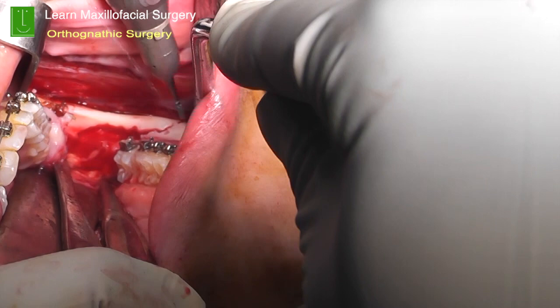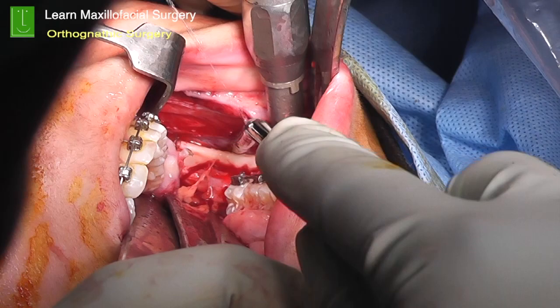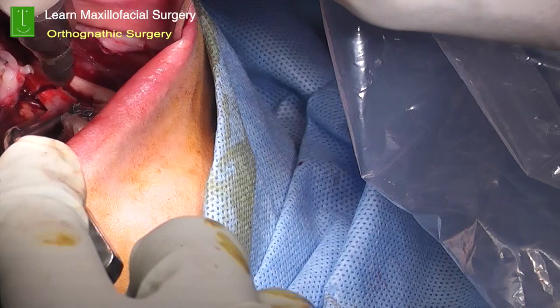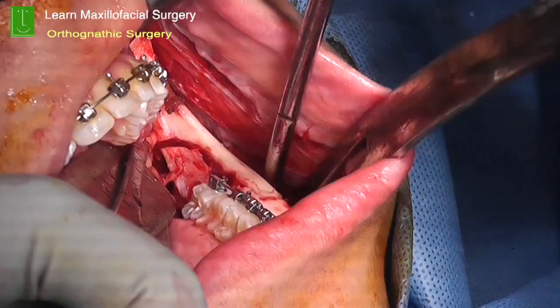Using a straight fissure burr, starting from the lower border of the mandible, come superiorly in a straight line, and then give a smooth round off as you come to the top and engaging the vertical cut. So the lingual cut has a smooth curve to join the vertical cut, and the vertical cut has a smooth curvature joining the buccal cut. So doing this, you're able to split the ramus of the mandible in a sagittal plane, and that's how the term sagittal split osteotomy has been coined.